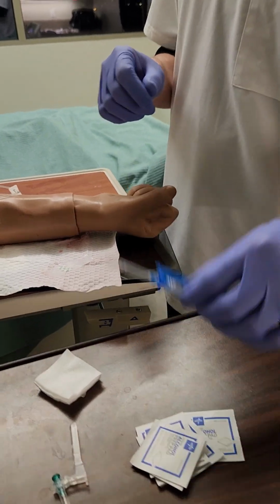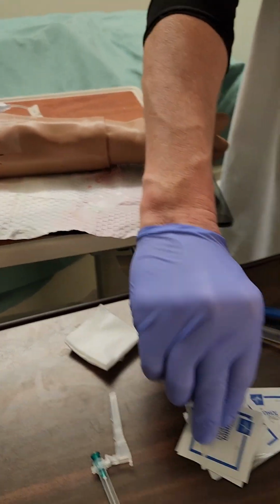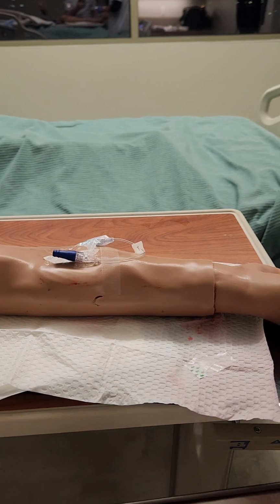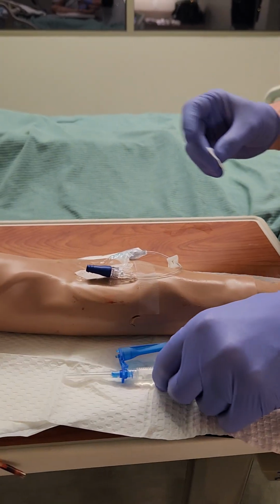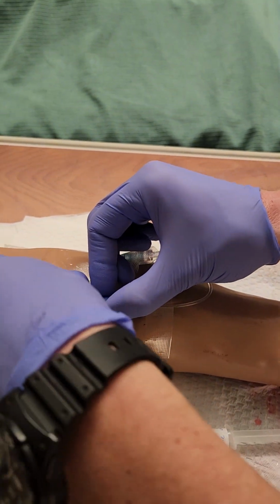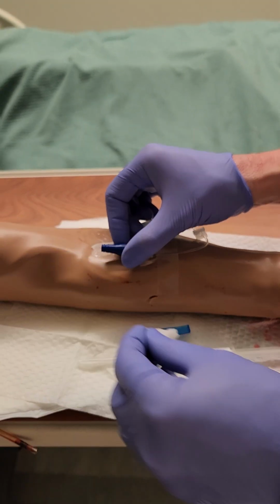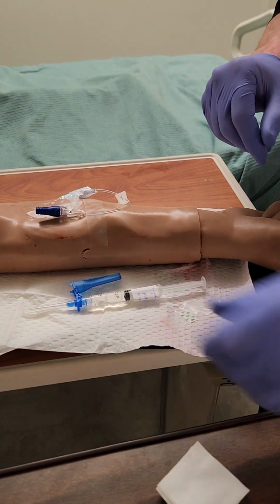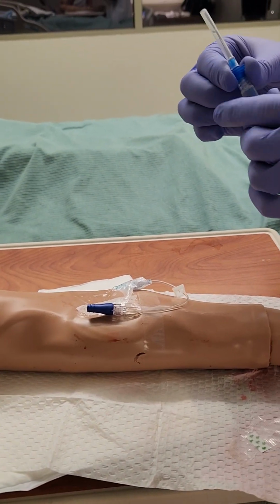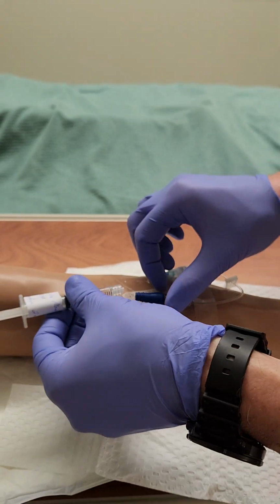So now what I want to do is clean that again, just because I handled it. And I'm a safety guy. I want to make sure that's all nice and clean. And so now I'm going to connect this, and I have to give this over the course of 4 to 5 minutes.